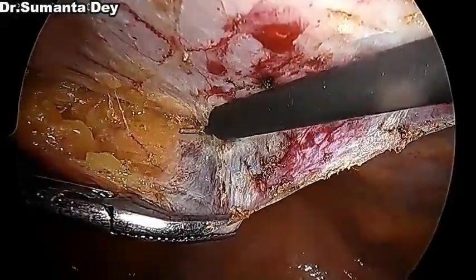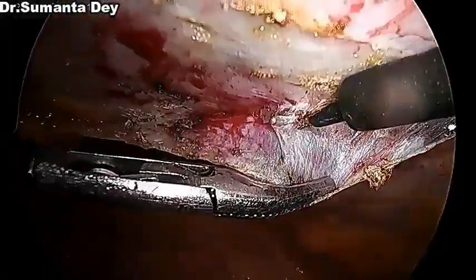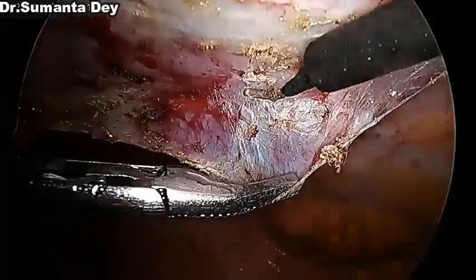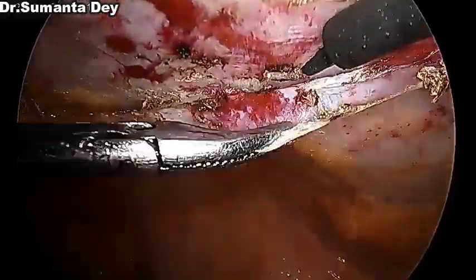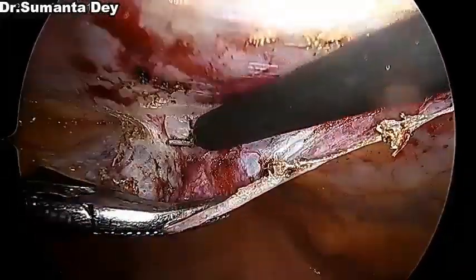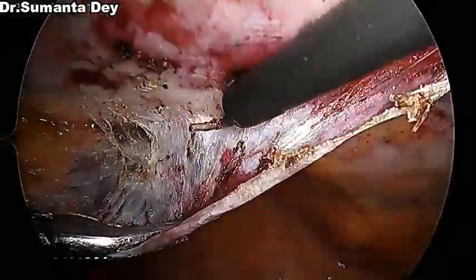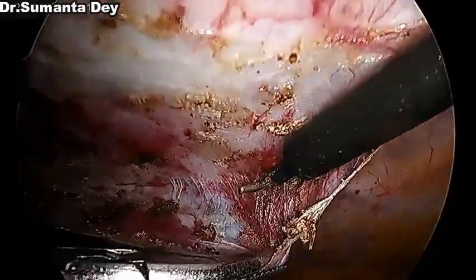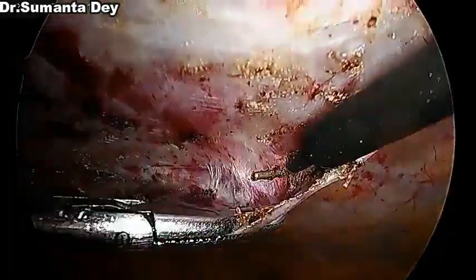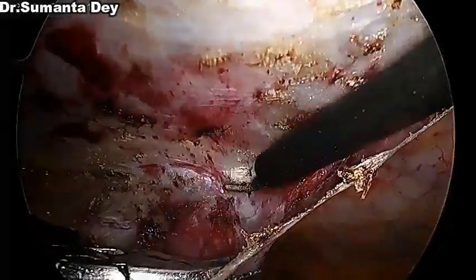And you can see I'm giving traction with the left hand instrument, and identifying the loose areolar tissue plane between the posterior rectus sheath and the peritoneum, with a little bit of cauterization and pushing it with the back of the hook. This step also can be done with scissors, cold scissors. Sometimes I do it with cold scissors, but this time I'm doing it with the hook.